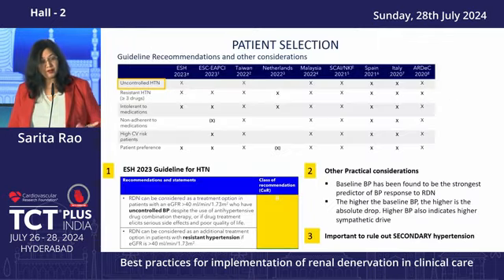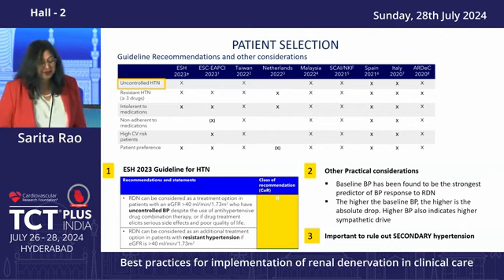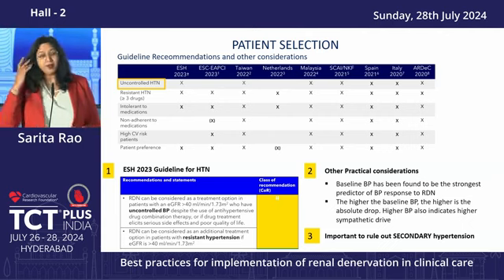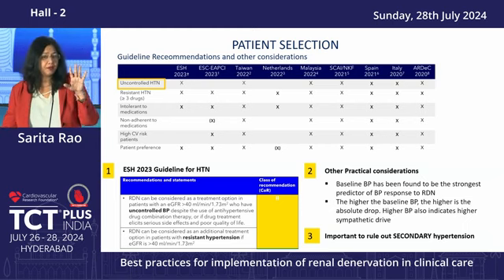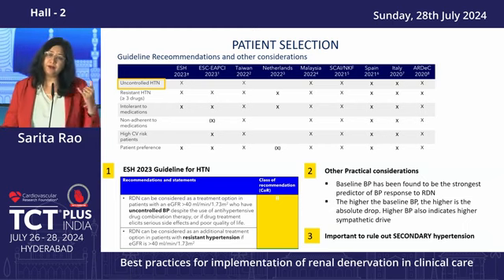And currently, this patient, after 3 years, is on 3 antihypertensives with control of blood pressure. That was the time we started believing in this procedure. So he was clearly a hyper-responder. Most patients don't respond like this. Most patients, you may be able to reduce maybe one medication, or you may be getting a better control of blood pressure. And of course, 20% of the patients don't respond because blood pressure is a multifactorial thing.